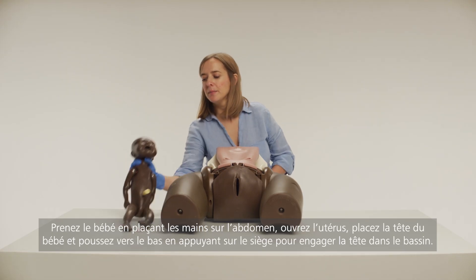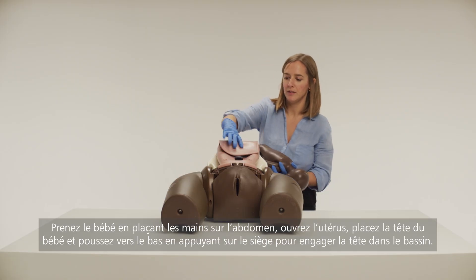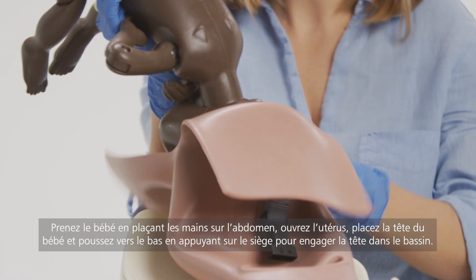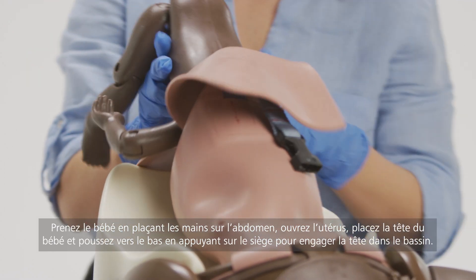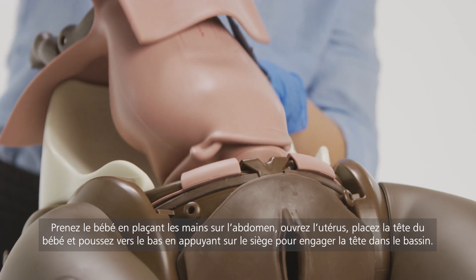Take the baby, placing the hands over the abdomen. Open up the uterus and place the baby's head inside. Push down from the bottom until the head engages into the pelvis.